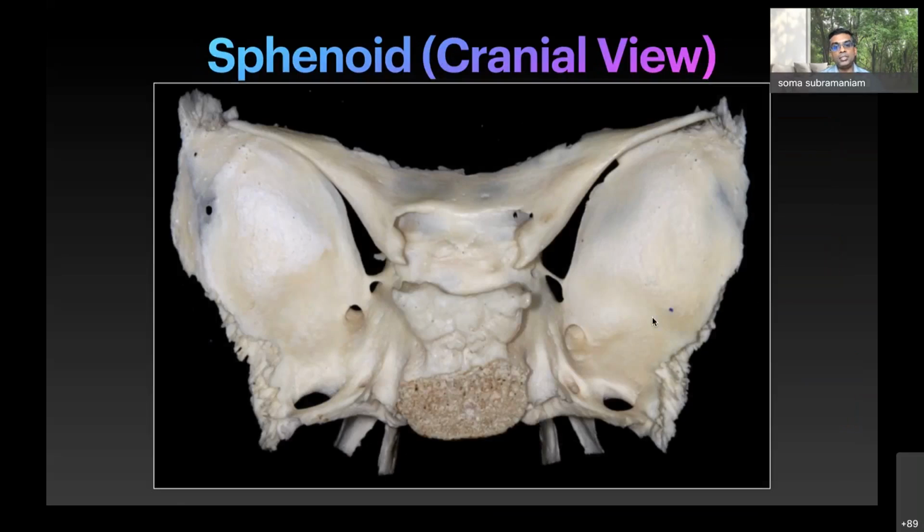If you look at the transcranial view from the top, this is not an endonasal view, but it's good to have a 360 degree idea. So right at the top, at the roof of the sphenoid sinus, is the planum sphenoidale.